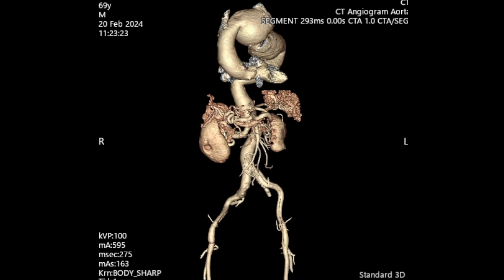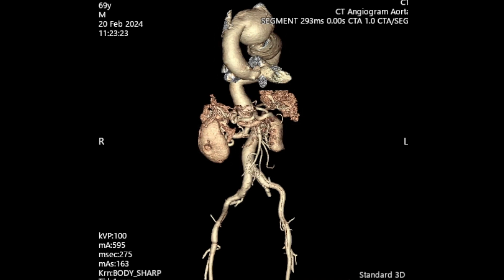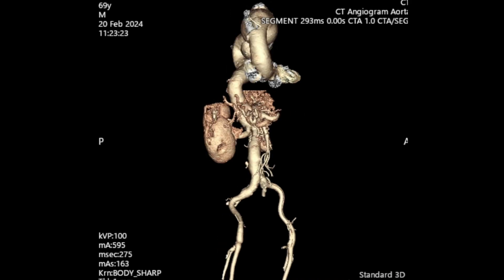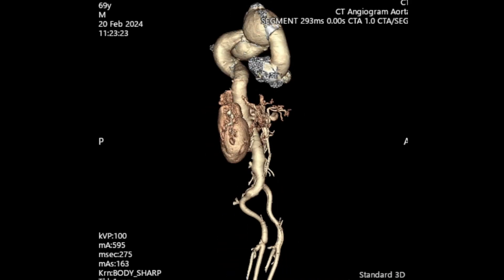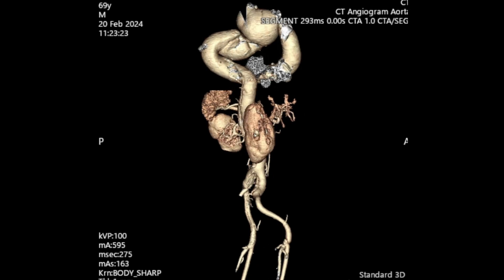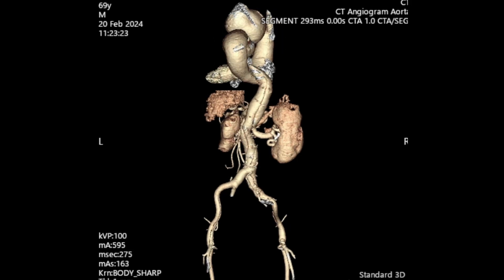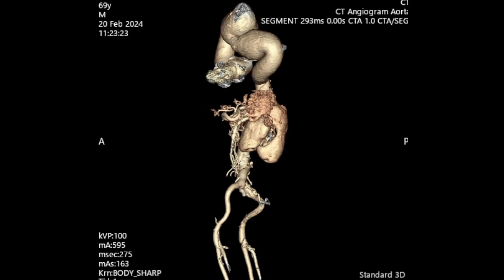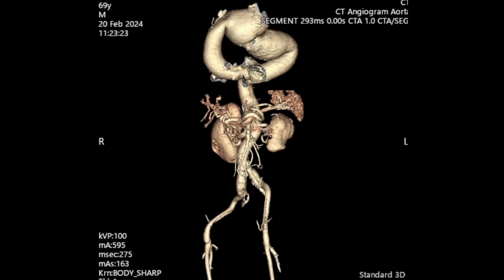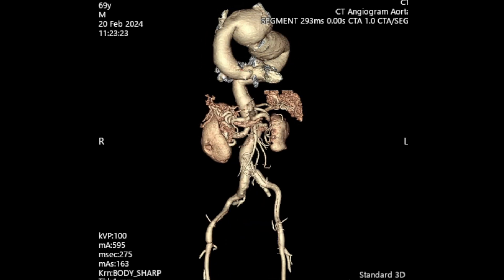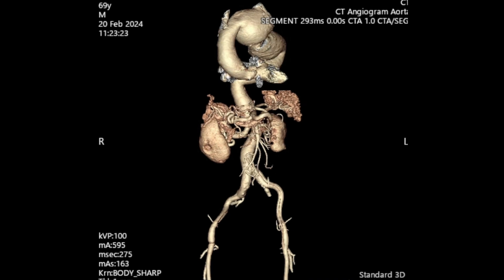The second part of the operation is to replace this patient's leaking aortic valve — he has moderate aortic regurgitation. It's impossible to do a circulatory arrest with a leaky valve, so we're going to replace it with a tissue valve. Then we'll perform a combined sternotomy and thoracotomy incision to expose the aortic aneurysm from the proximal end at the mid arch to distally in the inner descending aorta.